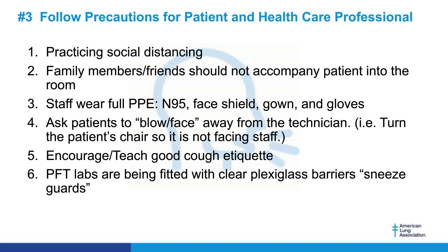Well, basically, following the precautions for different healthcare professionals, we have to keep in mind social distancing, both in the laboratories of our staff members, but also out in our waiting areas too. Since COVID hit, we're testing the patients by themselves. In the past, a family member sometimes would come in, or in our pediatric lab, we would always have the parents come in, and no longer. If the child's old enough to participate in the spirometry maneuvers by themselves, we have them come to the lab by themselves. All of the staff are wearing full PPE.